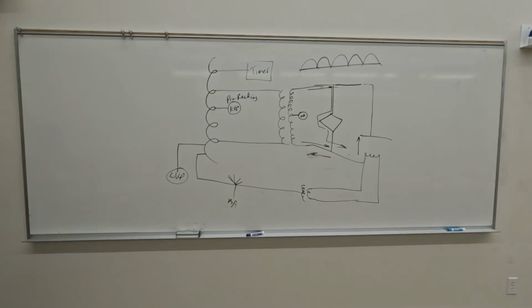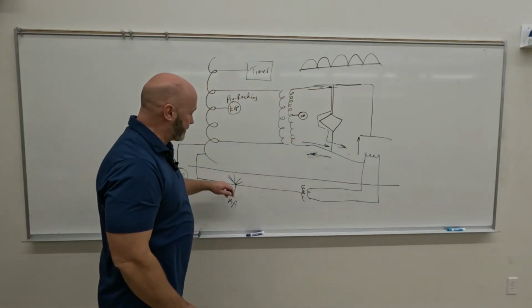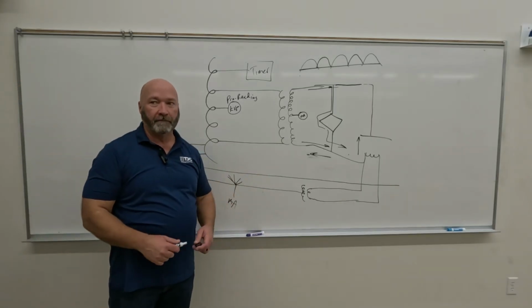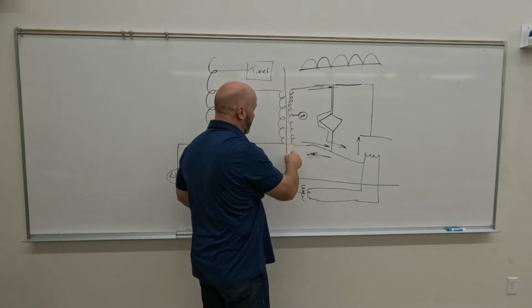Fundamentally the biggest difference is that I'm going to have a line drawn right above the step-down transformer and the MA selector, and I'm going to call that the filament circuit. Another thing is I'm going to divide the main circuit in half right there.